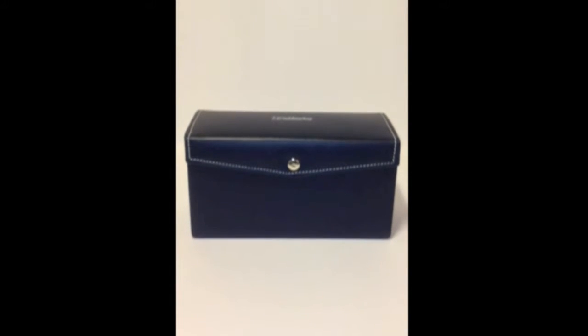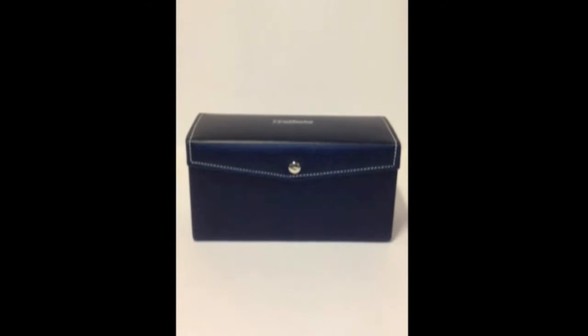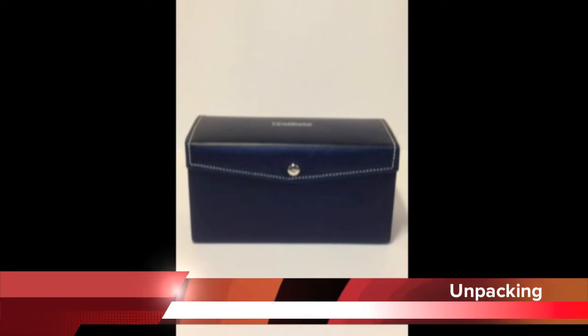Welcome to the demonstration of PD6000 Pro Breath Analyzer by Subtronix. We shall now show you the contents of the box packing by unpacking it.